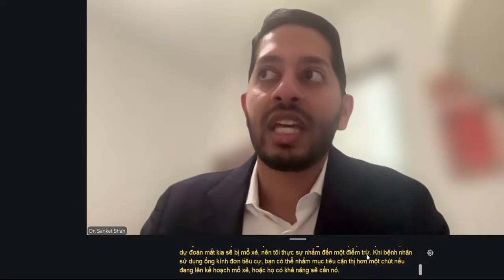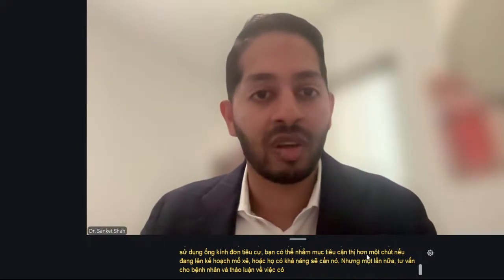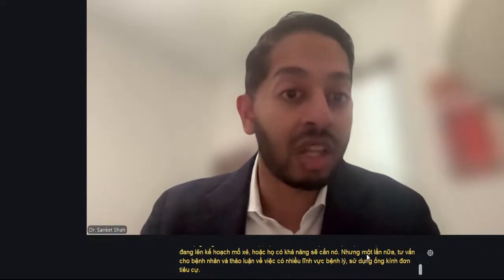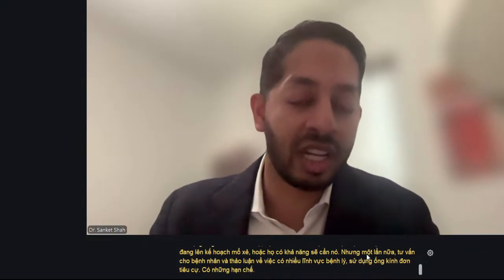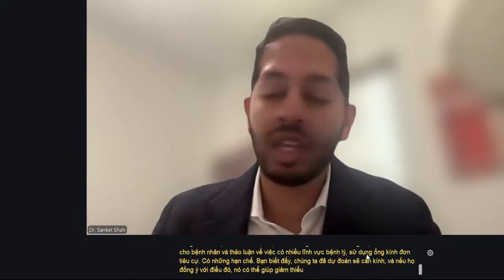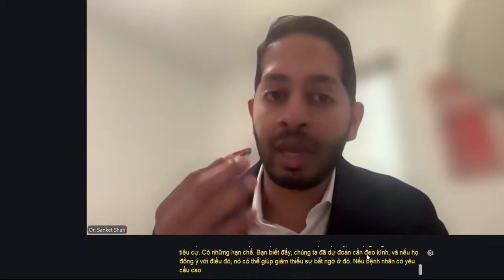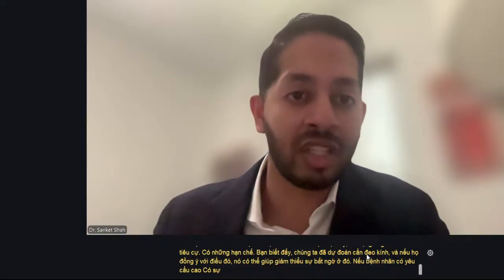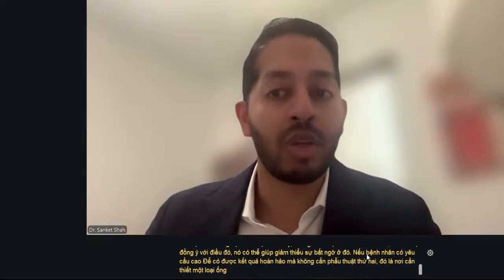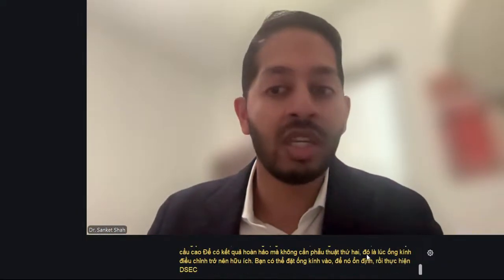But again, counseling the patients and discussing that there are multiple areas of pathology, and with a monofocal lens there are limitations. We're already anticipating needing glasses, and if they're okay with that, that can help mitigate the surprise there. And if the patient is very demanding of having that perfect outcome without a second surgery, that's where something like the adjustable lens comes into play, where you can put the lens in, have it stabilize, then do the DSEK, have it stabilize, and then do the adjustments.